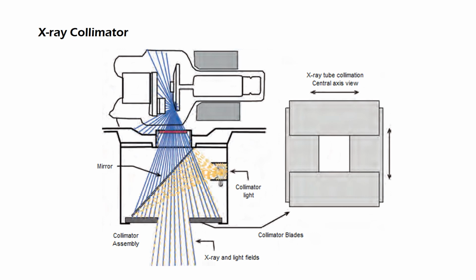The collimator light is mounted inside the collimator. Slits are used to limit the light to a specific shape and size. A radiolucent mirror positioned at a 45-degree angle to the light source allows the light to be reflected at a right angle and create a rectangular or square field of light on the patient.